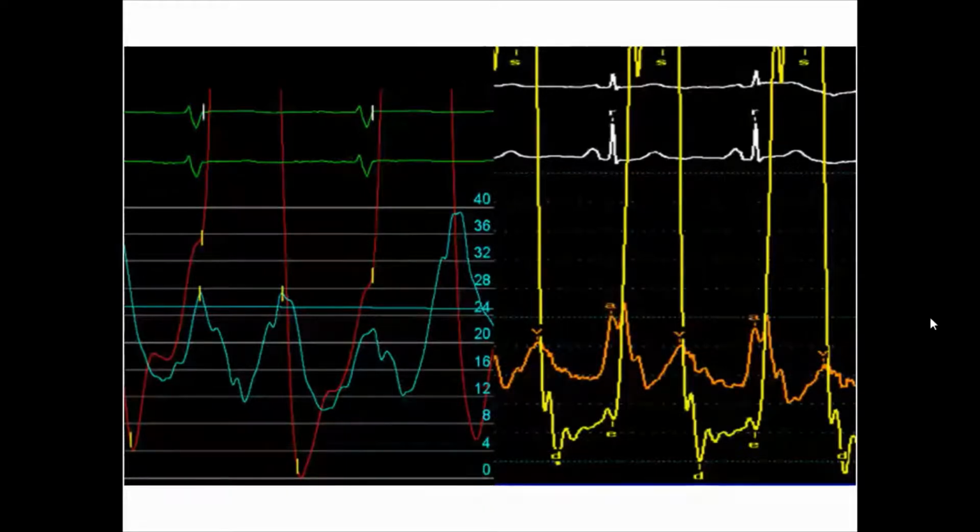If you mention all the findings, ultimately we will reach a diagnosis. I help you: your left hand tracing is normal, your right hand tracing is abnormal. The network is very bad. Okay, who can go ahead?